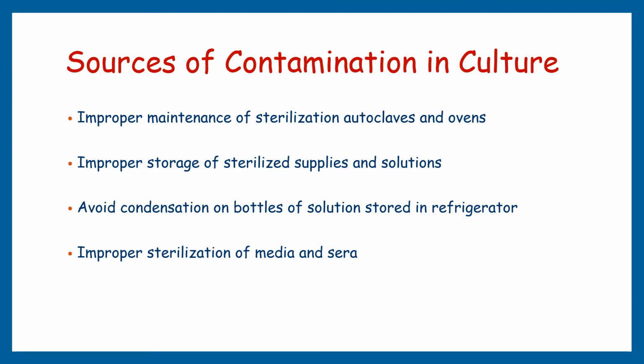Another thing we should care about is the proper storage of autoclaved supplies or solutions. Storage should be in a dust- or insect-free area to prevent recontamination. Care must also be taken to avoid condensation on bottles of solutions stored in refrigerators or cold rooms.